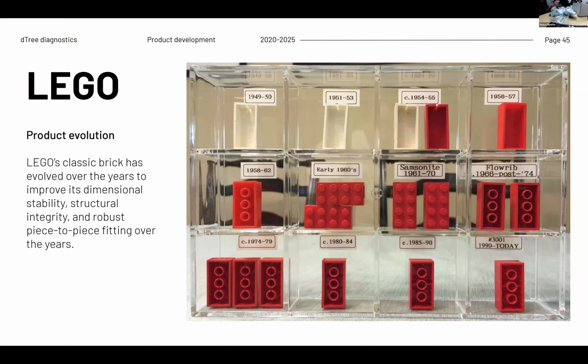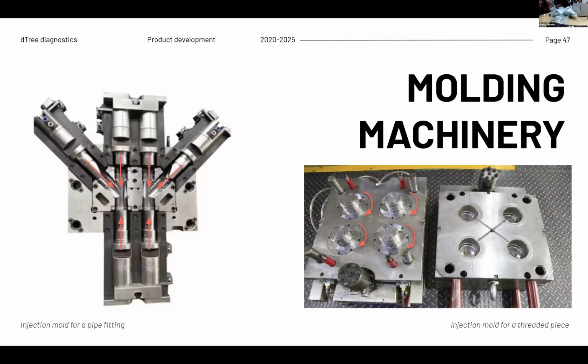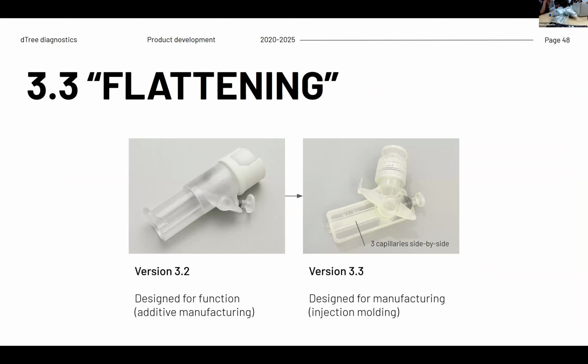This is the injection mold part. But yeah, to get from here to here, basically there's a huge flattening out, you can see, right? It doesn't need to be cylindrical for any reason at all, but for injection mold, it's just much easier to have two things that are just kind of top and bottom and a cavity. So that's kind of what we did.